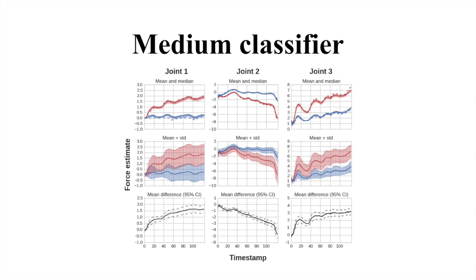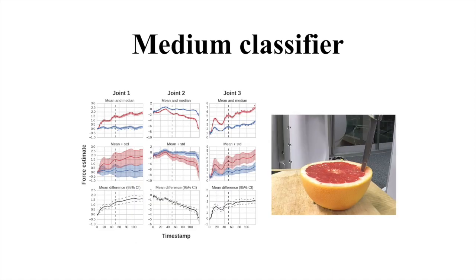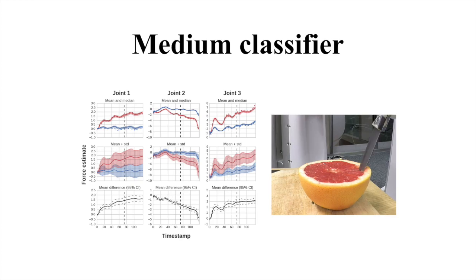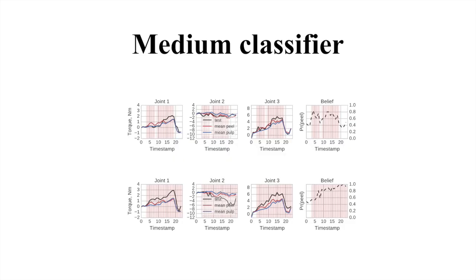and torque samples from the failed task executions as peel. Such a training process is inherently noisy, since all of the 24 torque samples in the sensor trace share the same label defined by the outcome of the task execution. This means that even if the knife was closely following the desired boundary throughout most of the execution but got stuck in the peel at the very end, all of the 24 torque readings would still be labeled as peel. However, we believe that such training forces a more conservative probabilistic model.